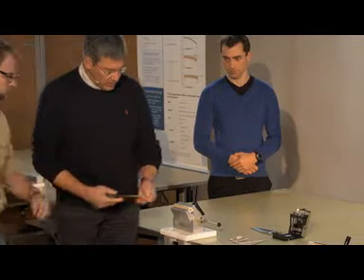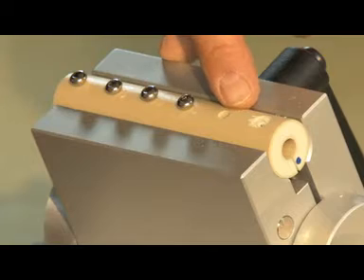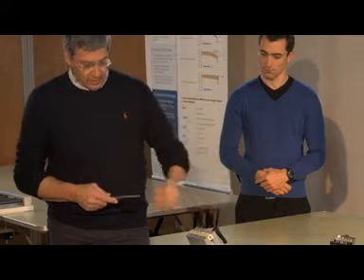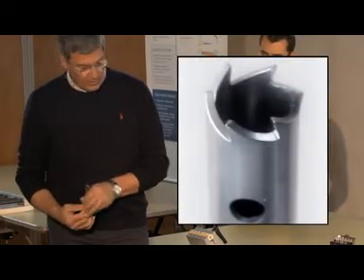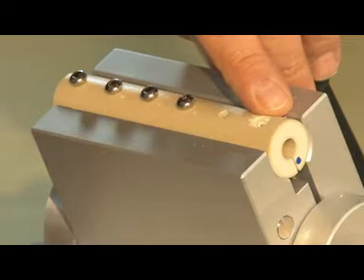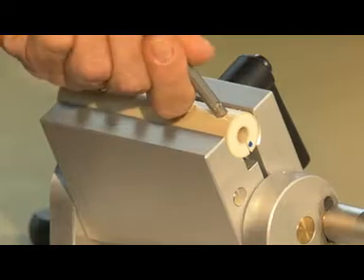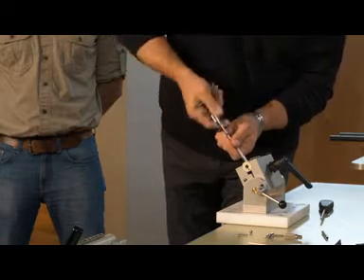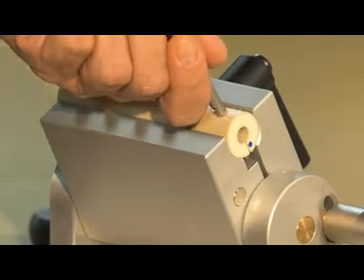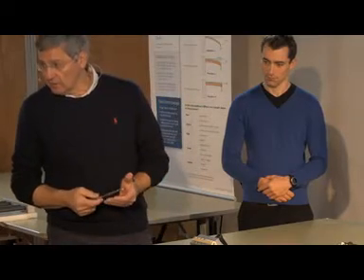So now we have the problem of having to remove the screw. We have to make room around the screw in order to be able to extract it. We do that with this instrument here. We have prepared this in order to make it a little easier. So I want you to take this instrument and try to drill around the screw in order to make room for the actual instrument with which we will extract the screw.